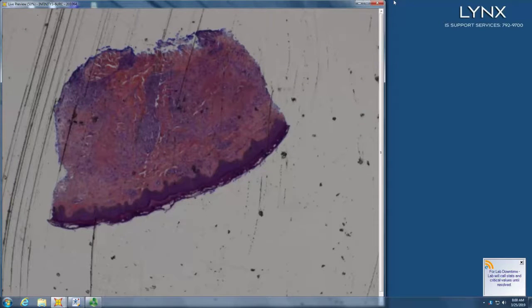So that's why plastic cover slips are the work of the devil, right? Because they don't last. So there's palisading granuloma with some necrobiosis in the middle. Yeah, or fibrin or something. So what are you thinking? So it doesn't look naked. I want to go in on a bug hunt, make sure there's no weird infection. So bug hunt is reasonable. What else?